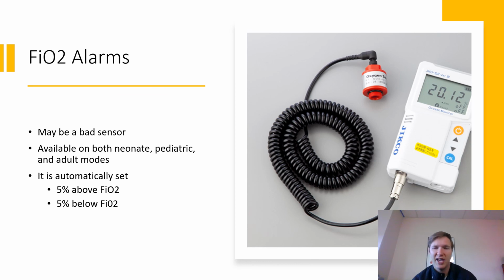Other machines, I know the 840 by Medtronic allows you to disable that alarm until they change it as well. But still, you're not going to just cover it up. You're going to make sure that you notify the proper people and get it taken care of. But that way, at least you avoid some alarm fatigue, right? But still follow the proper channels when you're doing this.